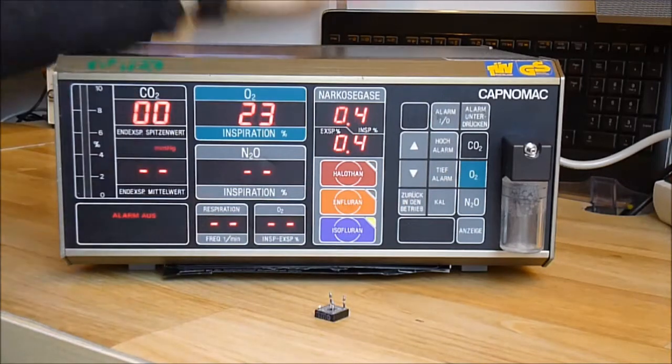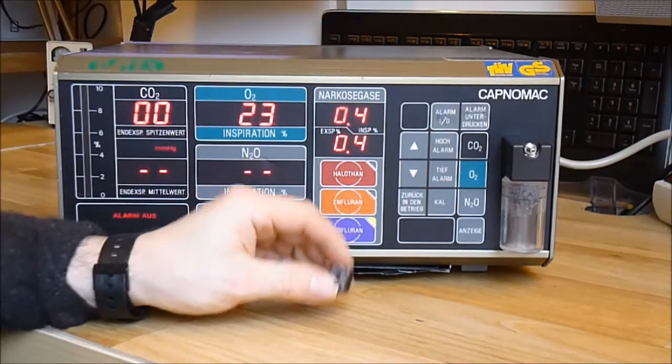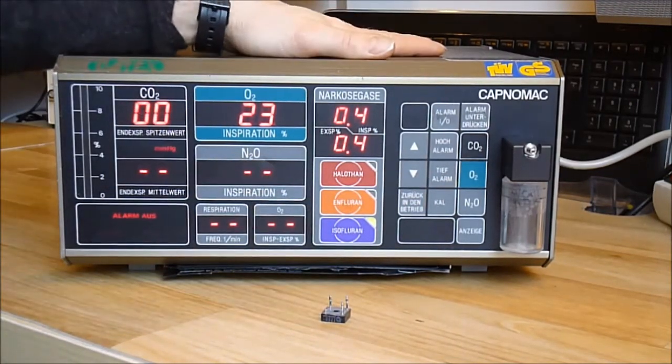So, I am quite happy it is repaired. I will crack it open but I do not think there will be anything to see anyway. Thanks, and bye bye.